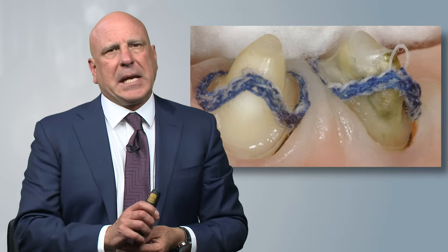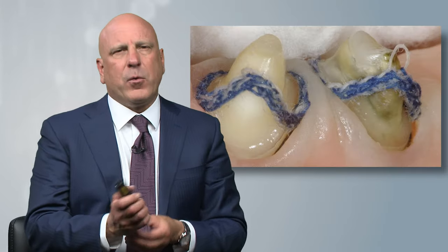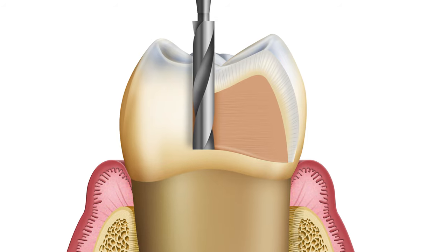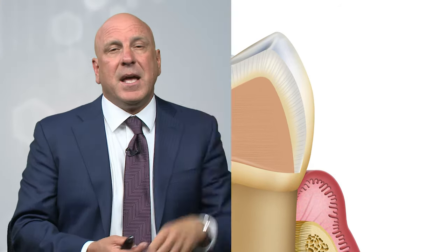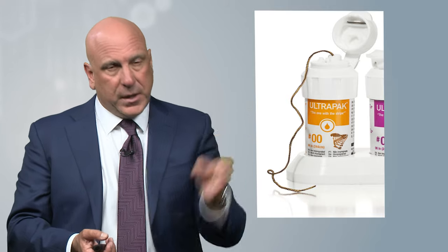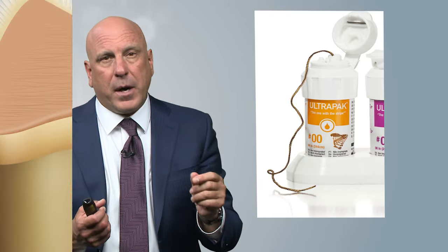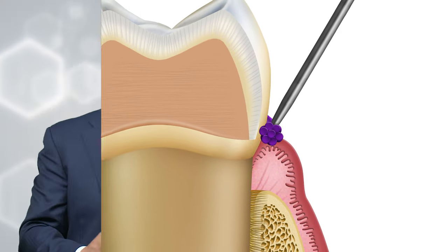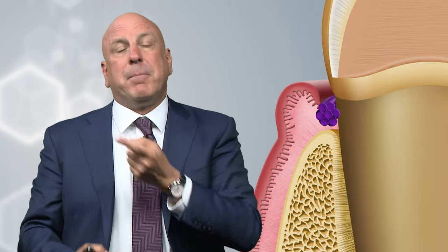Now as we look at this picture, let's backtrack a little bit. If you remember from the prep module, the way the two-chord technique takes place as it integrates with the reverse preparation technique is that I break the contacts first and foremost. So if we're prepping a central incisor or a lower molar, we break the contacts. Then I take a double zero chord — the smallest one in the Ultrapack chord system — and we floss it into place, pack it, and cut the two ends so that it's flush at the base of the sulcus.